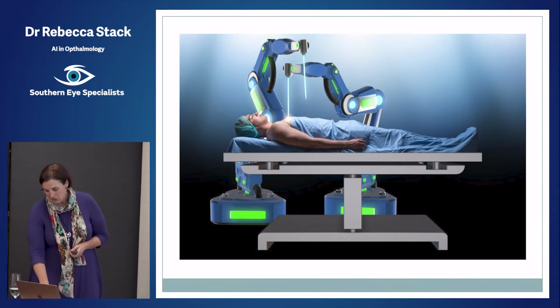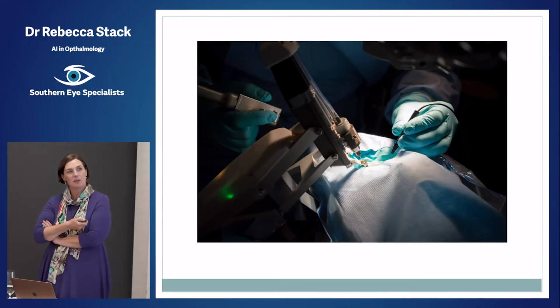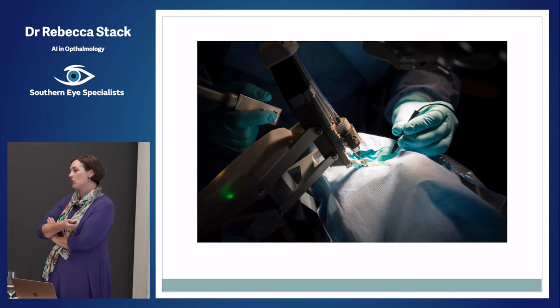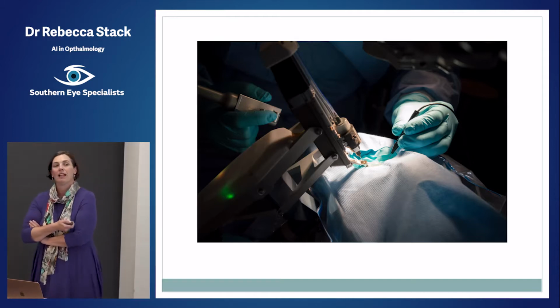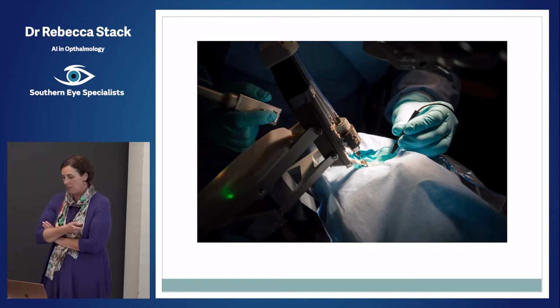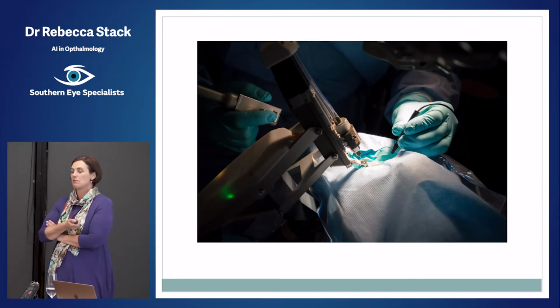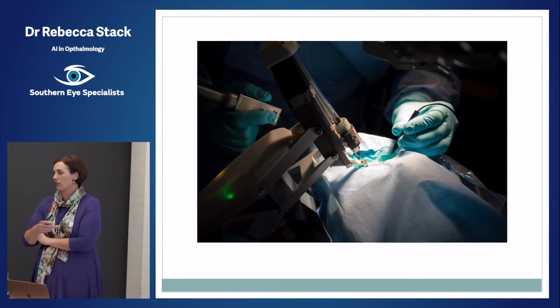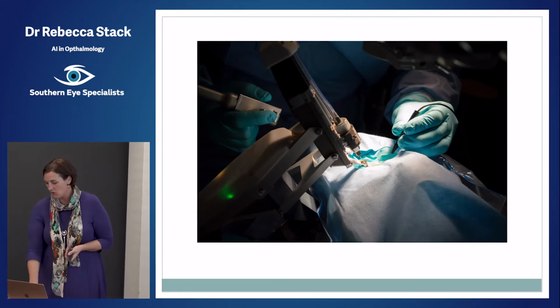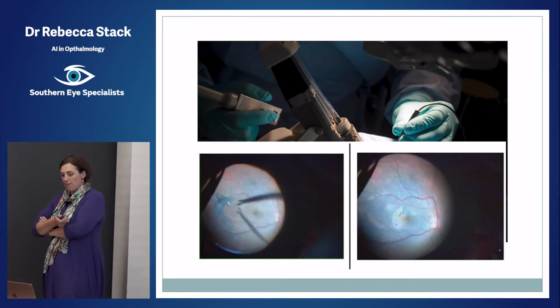So what about ophthalmology? What are we using robots for in ophthalmology? Well, this is quite astounding. So this is the first human clinical trial that's being done at the moment in Rotterdam on patients for epiretinal membrane peels by robot. So you can see that things like vitrectomy surgery would lend themselves really, really well to robotic surgery. Fine, detailed surgery on a delicate part of the eye where it's essential to not touch that macula.